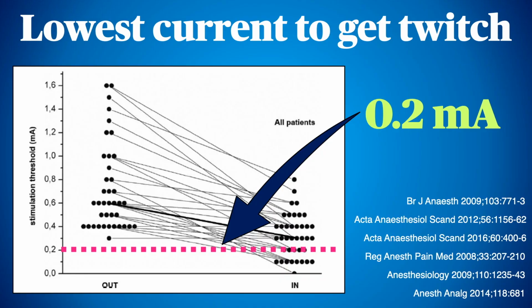So yeah, while you can get a variety of minimal current threshold responses when your needle tip is outside or inside the nerve, here we see the minimum current intensity needed to get a twitch varies immensely no matter where your tip is. The only time you'll get it at 0.2 or less is when you're inside the nerve. And that's how we use it now.